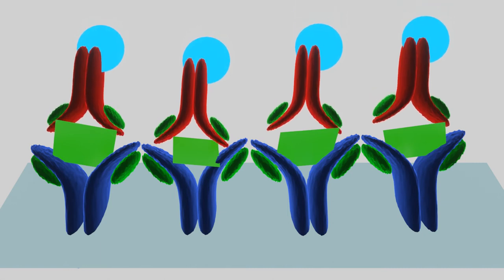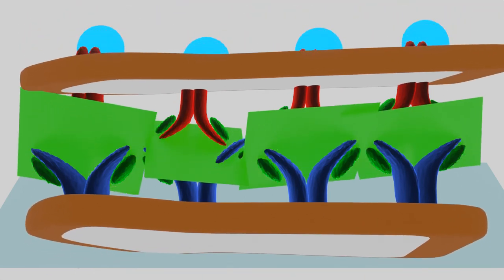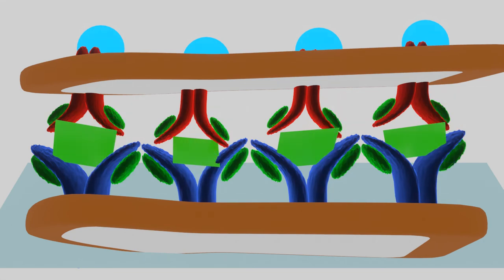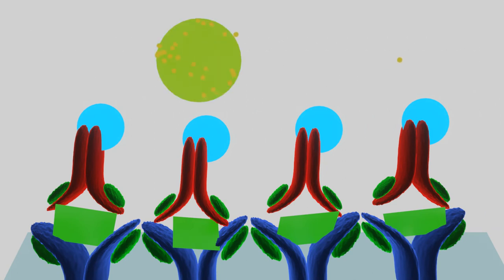Note that although both breads of the antibody sandwich are specific to the same antigen, they must be targeted to different sites of the antigen, because one epitope will already be occupied for capture. This improved version of ELISA, known as Sandwich, is the most commonly used in labs, especially to detect secretory molecules like cytokine.